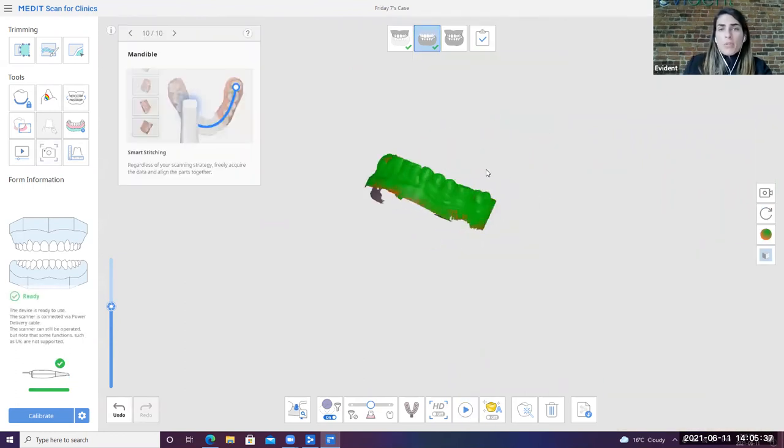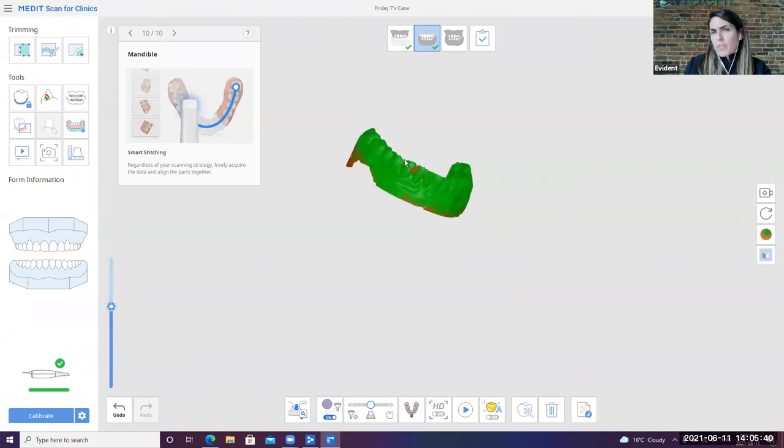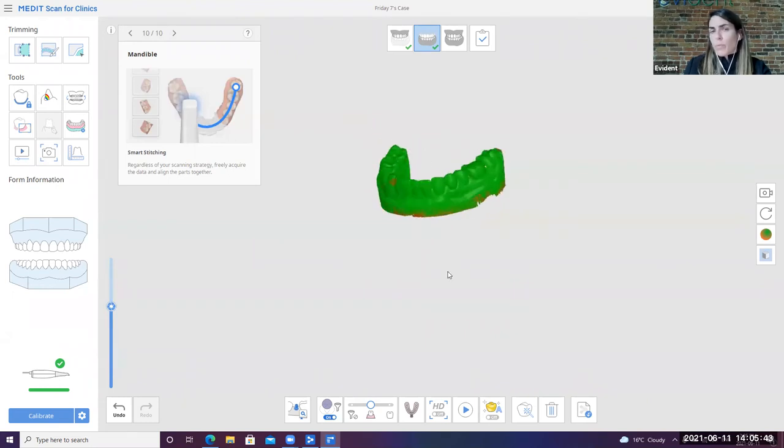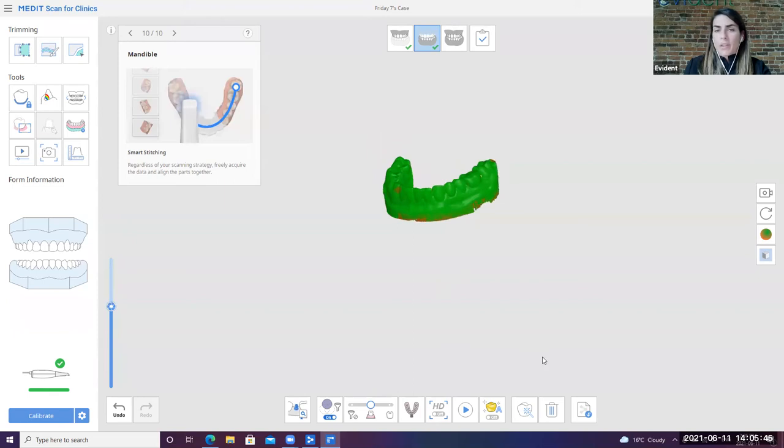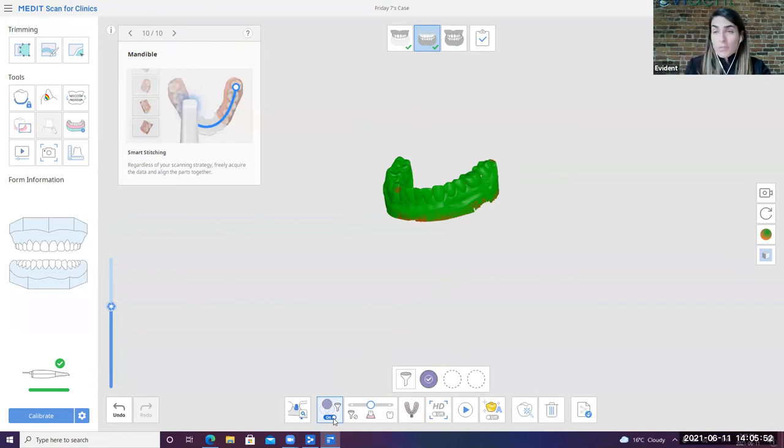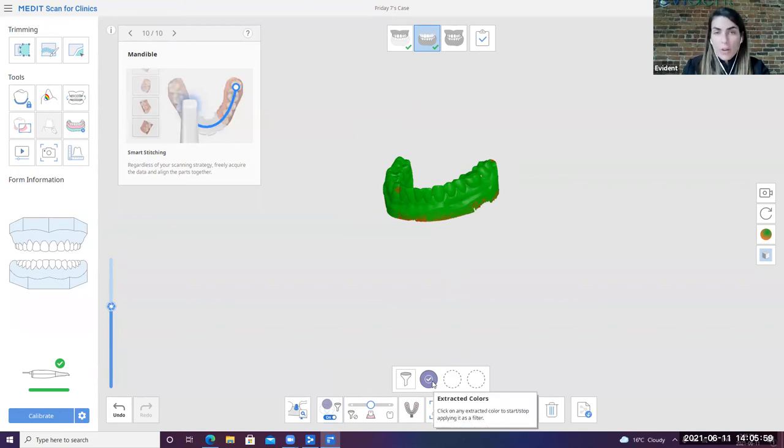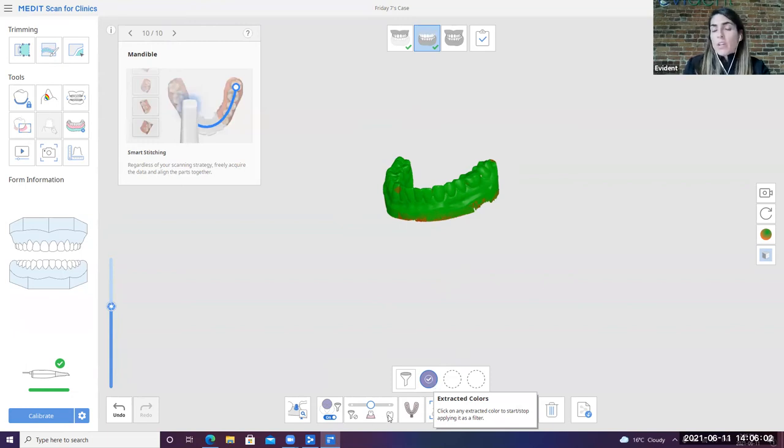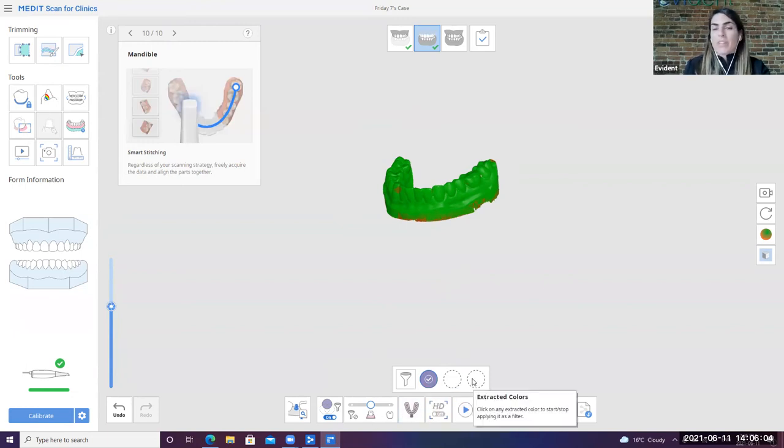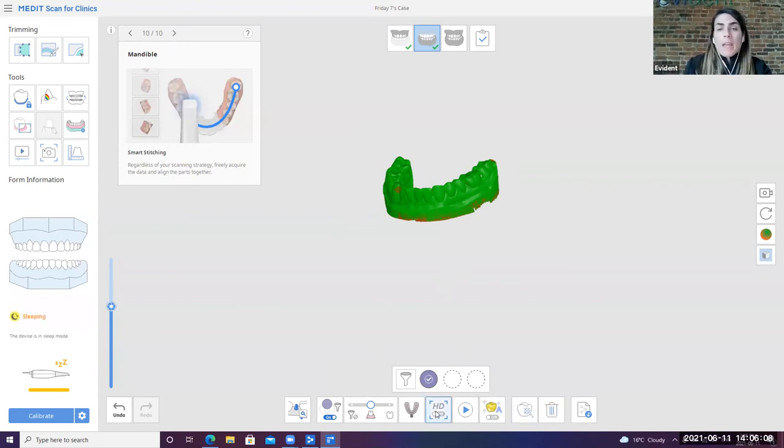Okay, so here we are with our scan, I've got a bit of a discrepancy here on the anterior, but for the sake of what we've asked for for treatment, that should suffice. Another quick note before I go into the bite is I did want to just quickly let you know that you can set your glove color with the Medit as well. So it allows you to be able to indicate those glove colors to say, for example, assistants have pink gloves or green gloves, and someone else has blue gloves, you can preset up to three different colors so that if you happen to have to be in the patient's mouth, your scanner's not picking that up.